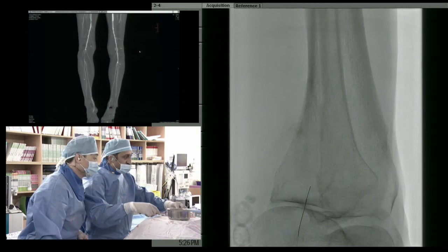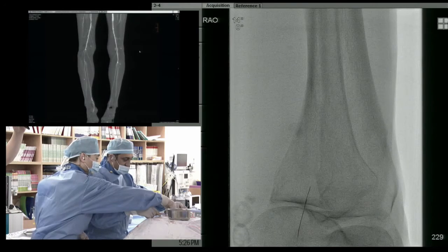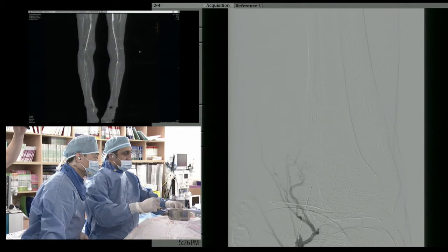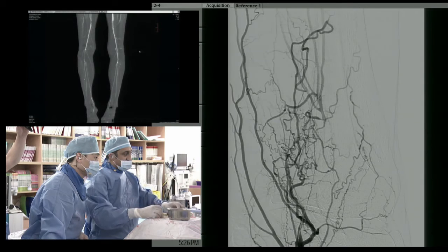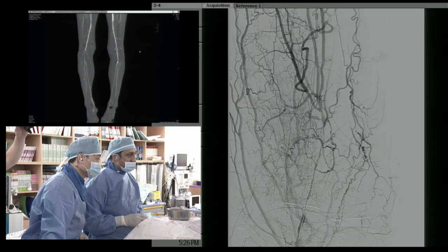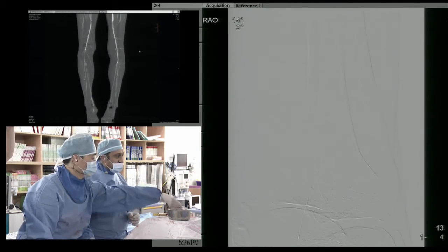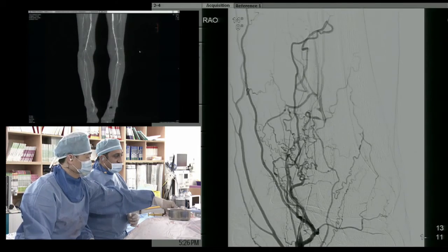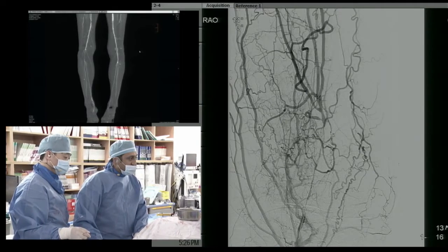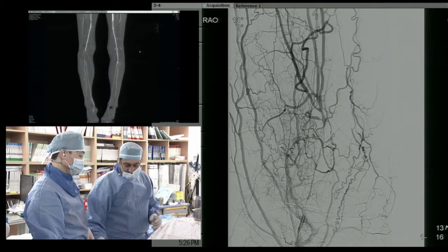You can see there right before the wire tip, there's a CXI tip. So is that projecting well? You can see there's the appearance of a channel, and we're going to try to follow that.